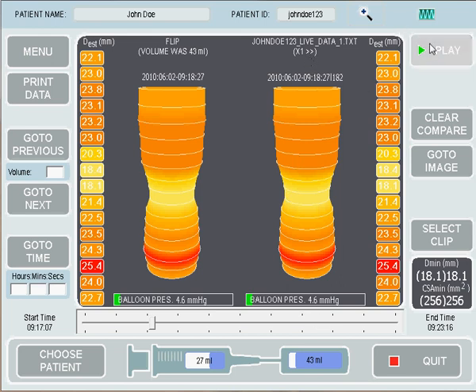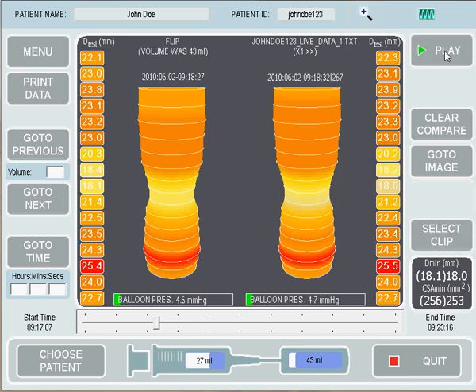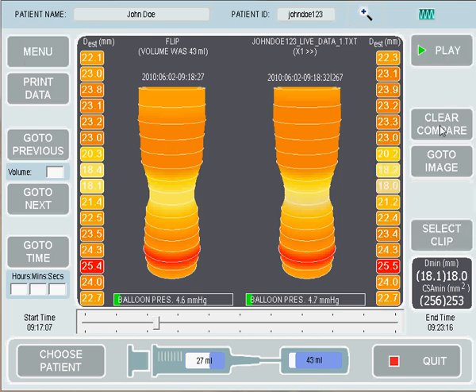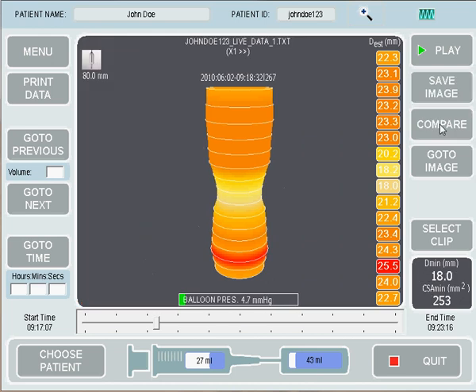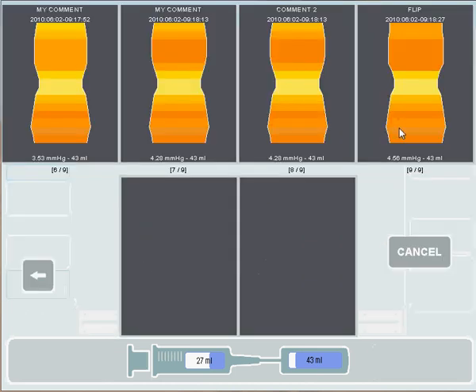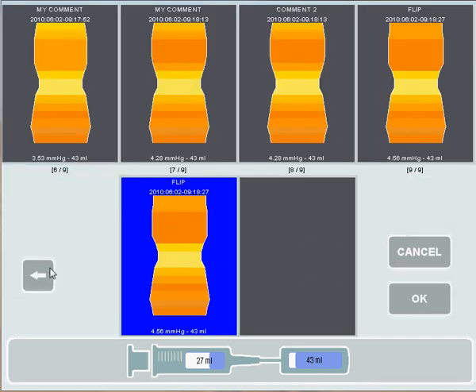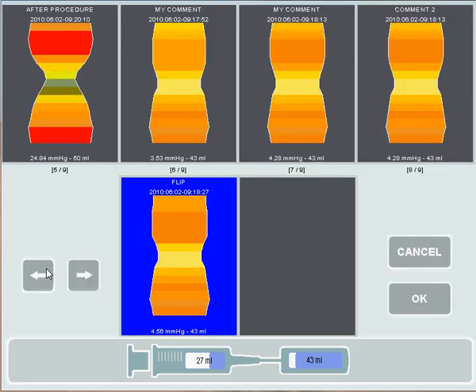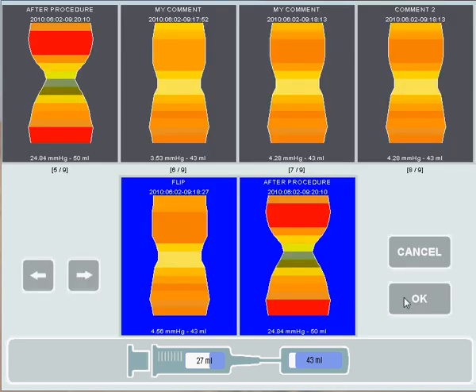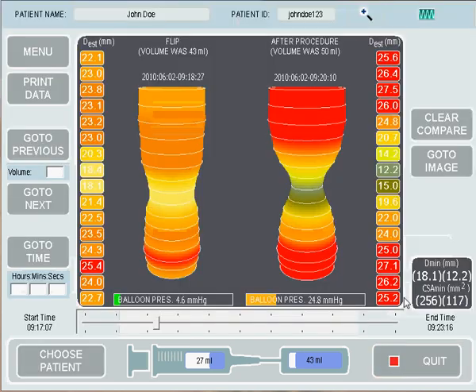We can press Play to play the data while keeping the snapshot still. If we'd like to compare two snapshots, we can clear that compare, press Compare again, and select two snapshots. So let's say we'd like to compare the flip snapshot with the after-procedure snapshot — and as you'll see, the two different snapshots are shown side by side.